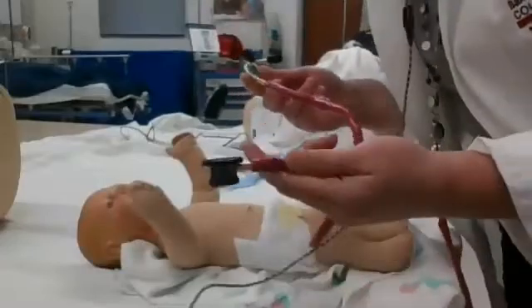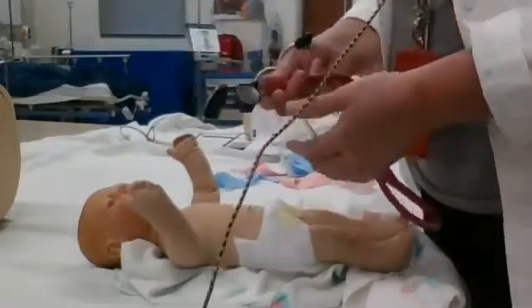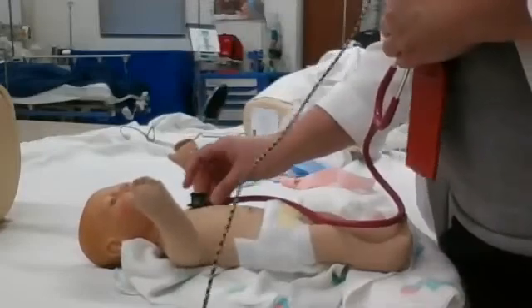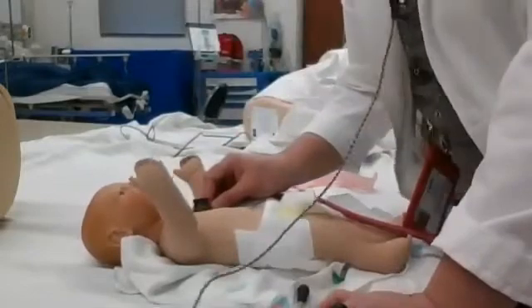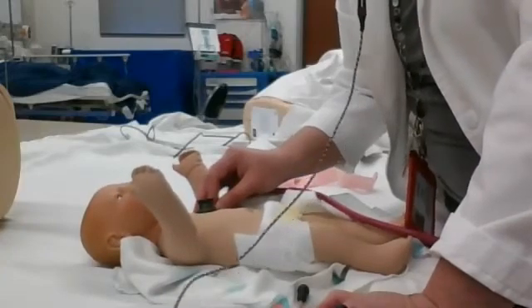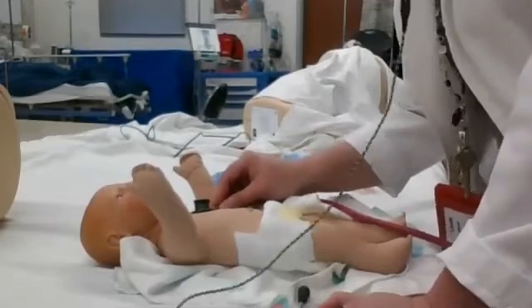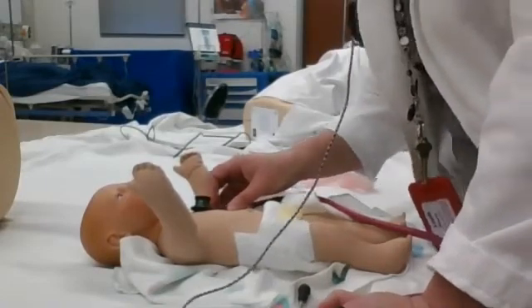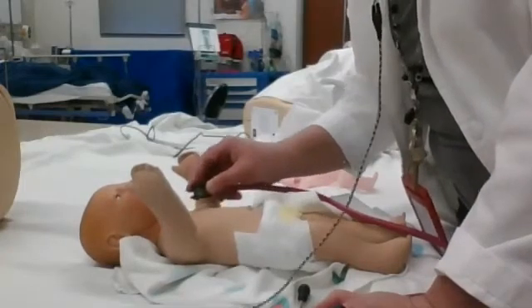When we're listening to the baby's vitals, we're going to use a stethoscope that is appropriate for the size of the baby. If you don't have the type of stethoscope with a smaller bell, you're welcome to use mine when you're in clinic. When listening to the baby's heart rate, put it on the chest — if the baby has a t-shirt on it's okay to listen on top of it, but warm up the stethoscope first so you don't startle the baby. Listen to the heart rate for at least 30 seconds, then double it for the full minute. For the respiratory rate, listen for a full minute because babies have unusual breathing patterns — they may have periods of apnea, holding their breath for 10 or 15 seconds, then do some catch-up breathing.